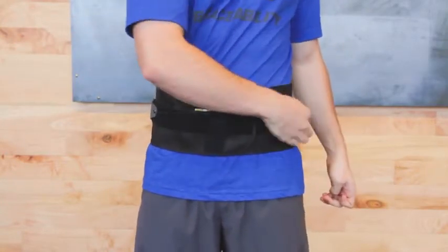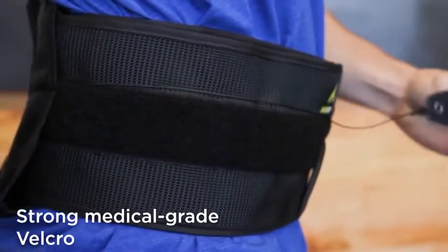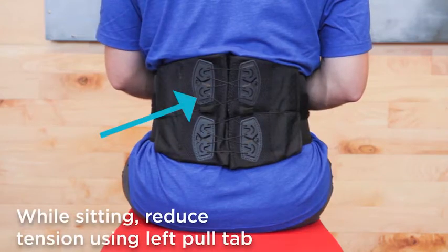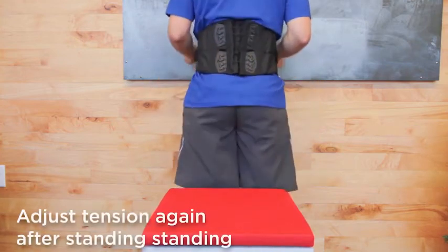Secure the strong medical grade Velcro to the Velcro compatible strip on the outside of the brace. For comfort while sitting, use the left pull tab to lessen tension on the upper portion of the back panel. Reapply tension once you stand up.